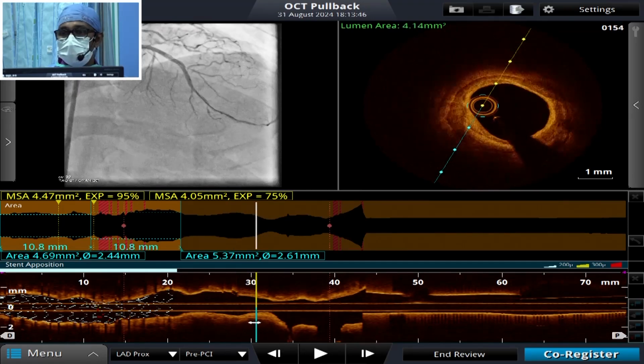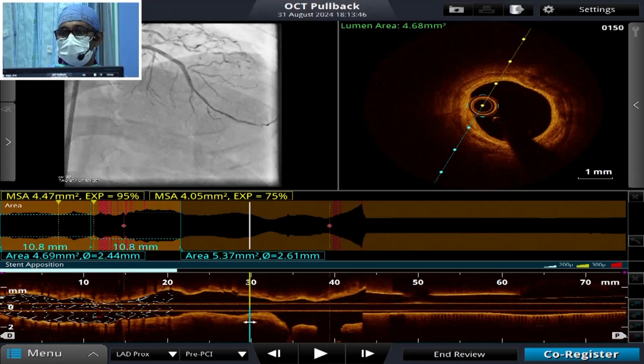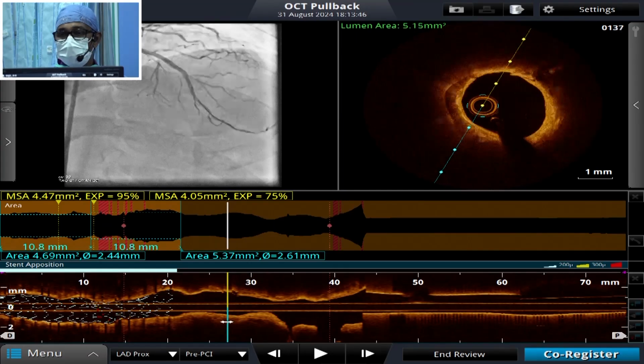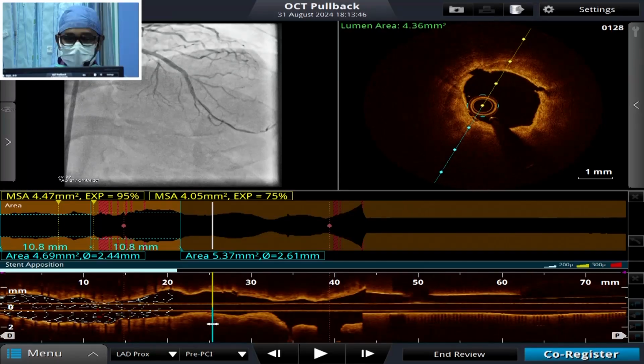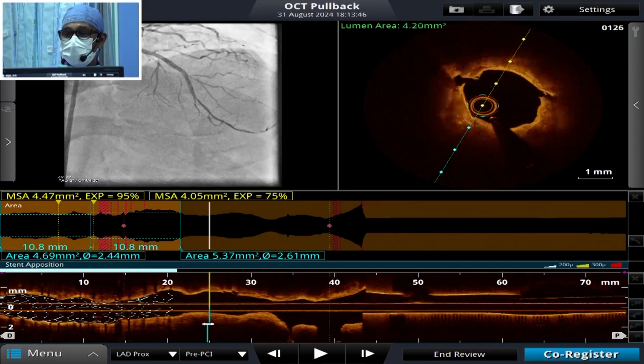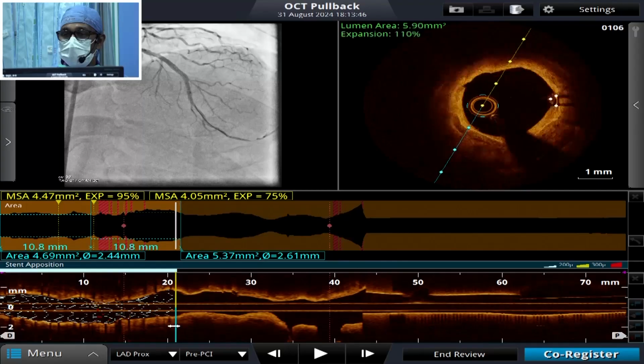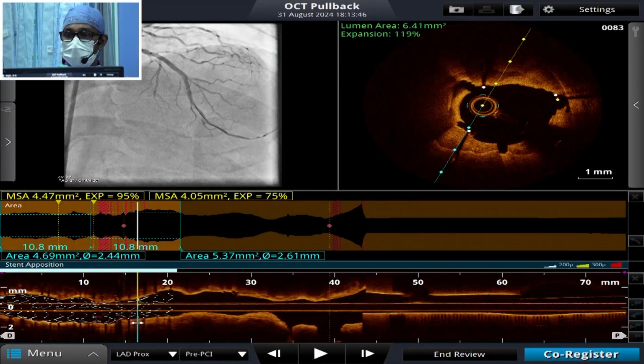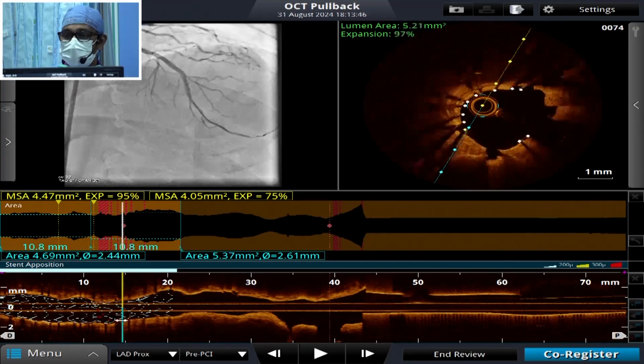Here it's all thin sheets of calcification, a 360-degree arc of calcification. Did we dilate this area also? We have a fracture here. Much proximal. Did we post dilate proximal to the stent? I think we have post dilated somewhere proximal to the stent, because we are seeing multiple areas of fractures. Probably the calcium was looking like a stent. Yeah, that's why we pulled it back and dilated.